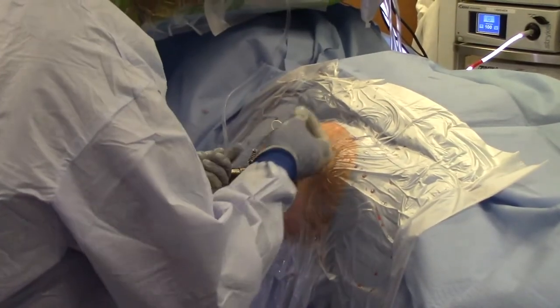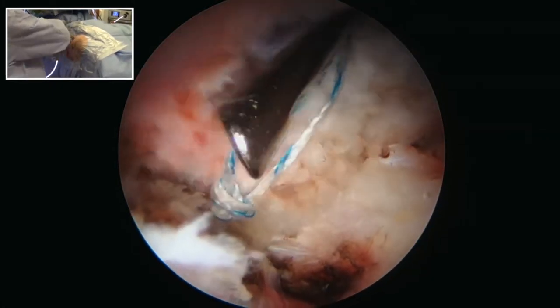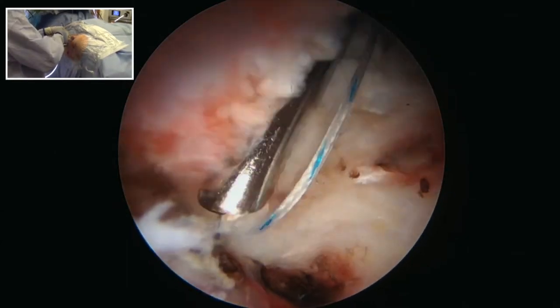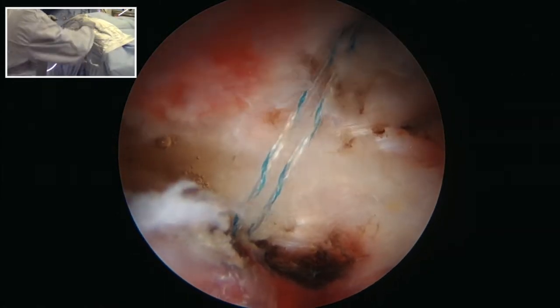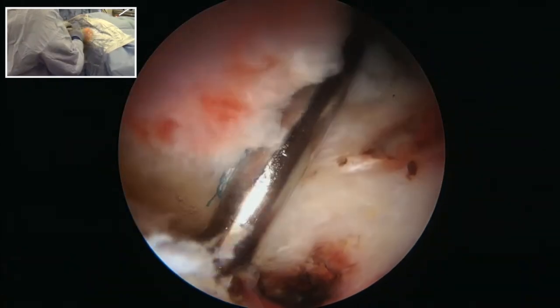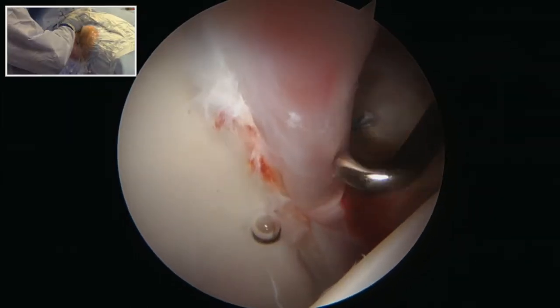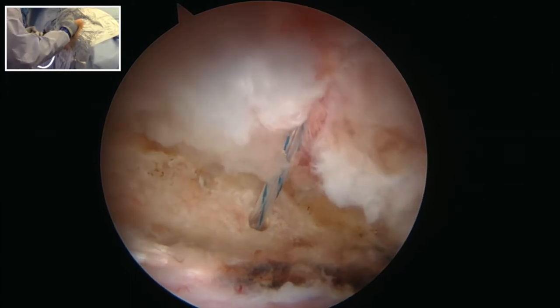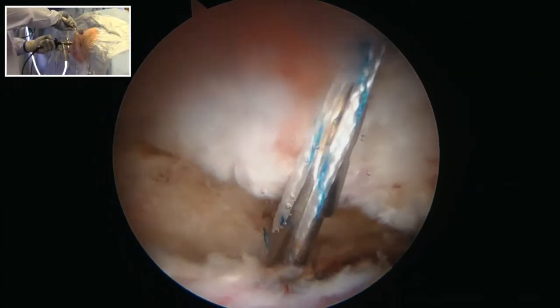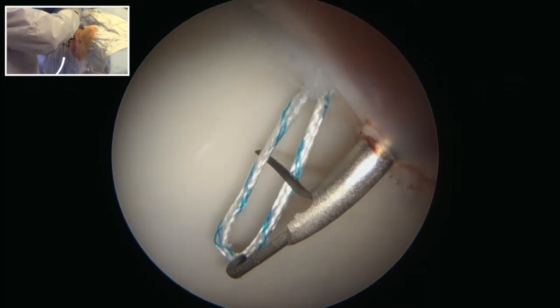A standard arthroscopic knot, in this case an SMC knot, is used to secure the labrum against the bone. As you place this knot, ensure that the knot is high up off the labrum and against the acetabular rim so the knot material is not interposed between the rim and the femoral head. The labrum is evaluated for its contour. A second anchor is placed slightly more posteriorly, approximately one centimeter away from the first anchor. Again, the labrum is secured using a vertical mattress type technique, with one limb at the chondrolabral junction, then retrieved through the labral substance to create a good contour for the labral repair.